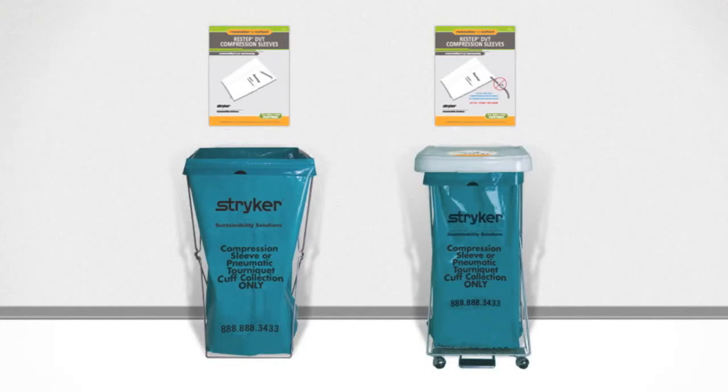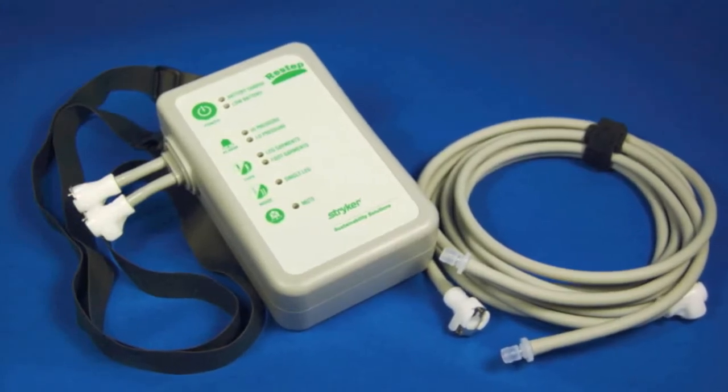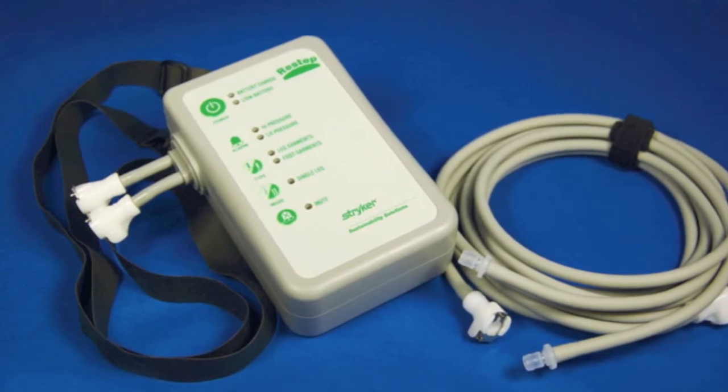The Restep garments will be collected in the same receptacle as other DVT compression sleeves. Only compression garments should be placed in these receptacles. The pump and pump tube set should be cleaned according to hospital guidelines and placed back in use after cleaning.